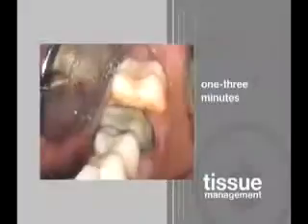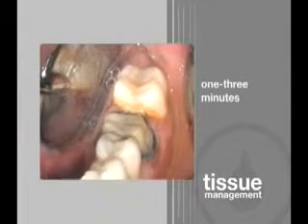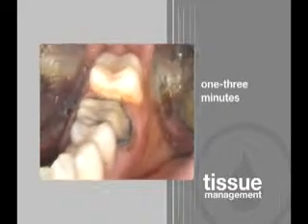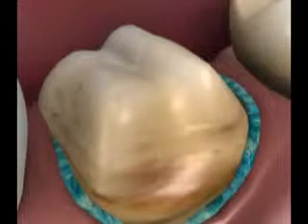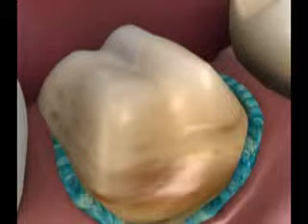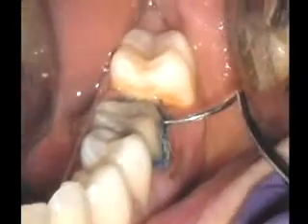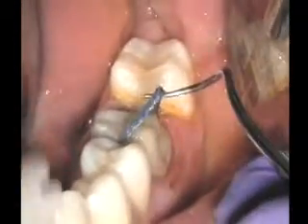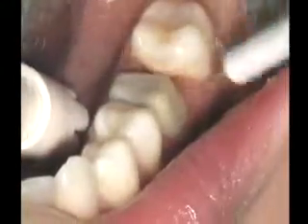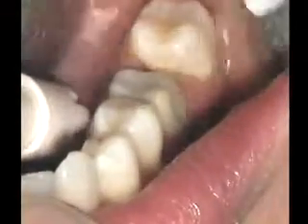The cords need to be left in place for only 1 to 3 minutes, rather than the customary 10 to 15 with other materials. Retraction is rapid because hemostasis has already been achieved. No blood is present to dilute the retraction agent in the cord. Remove the cord and once again clean the area and test for completeness of hemostasis with a firm air-water spray before the impression material is mixed.